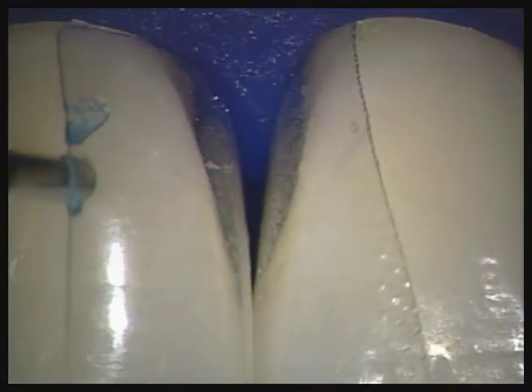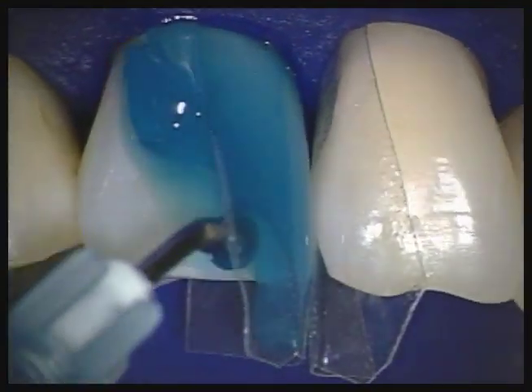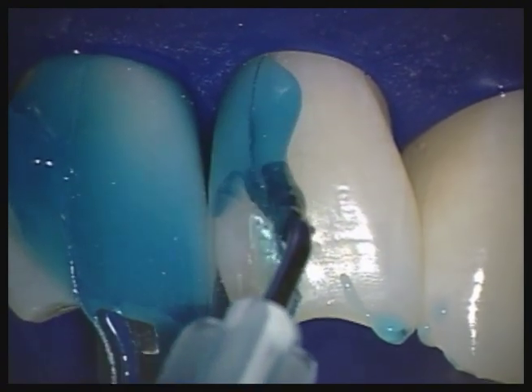You will learn to tease the BioClear matrix away from the tooth with etch tips, brushes, composite compules, etc. Alternatively, you or your assistant can pull the matrix open with an explorer to get access.